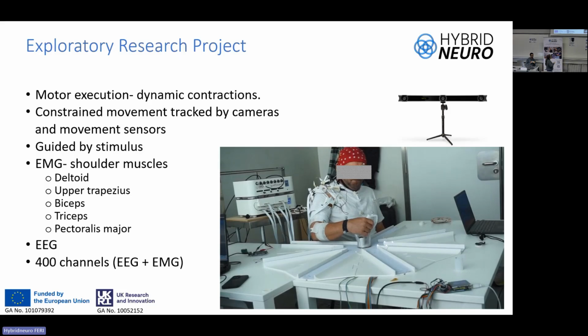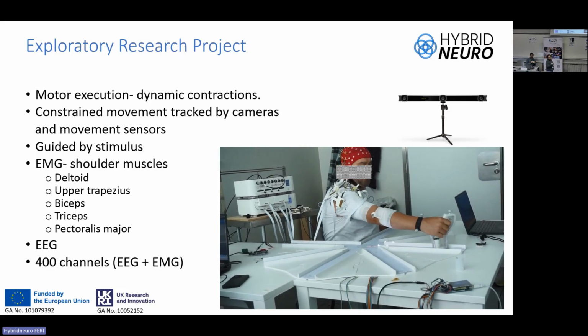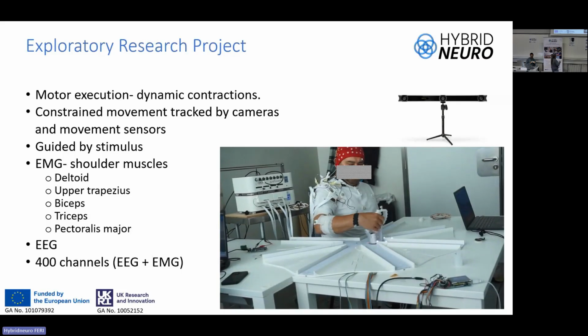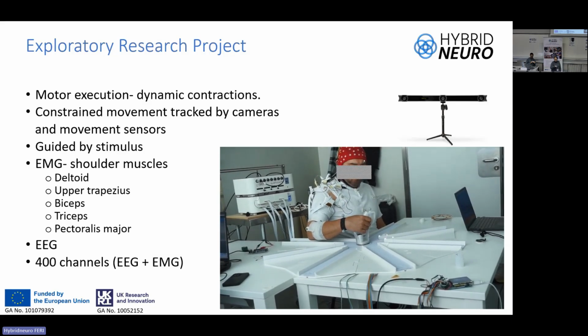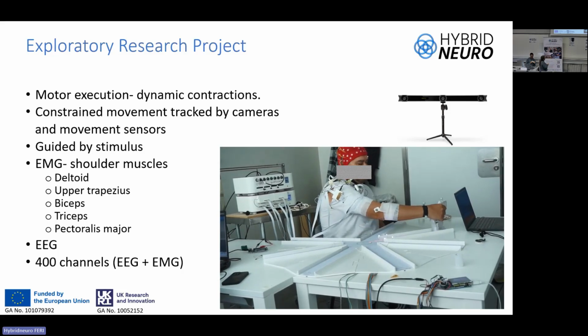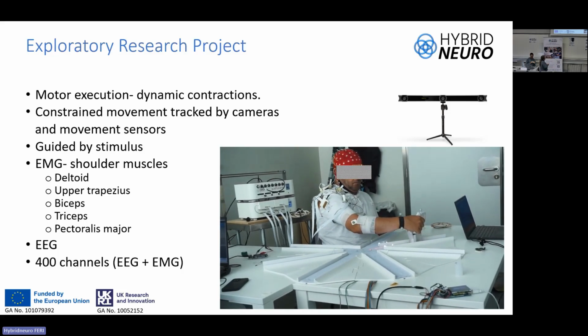So it has some guidance in here. It's guided, but it's not very constrained. We were aiming at trying to study this in normal conditions, in something related to daily activity. Then the patient has to follow these lines on the plane, and we are measuring signals in the EEG.